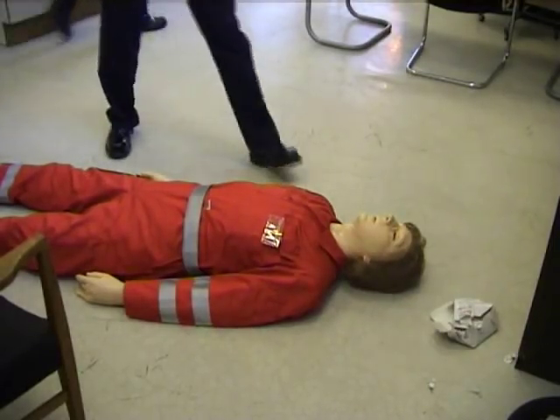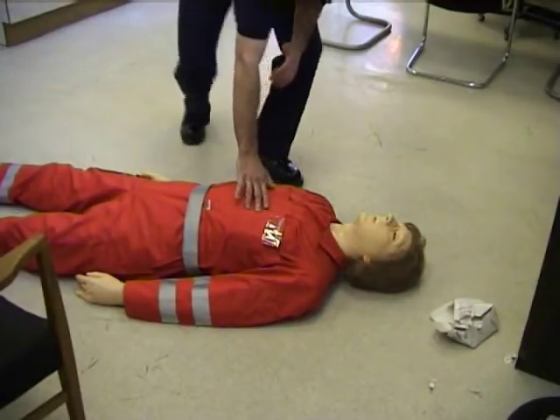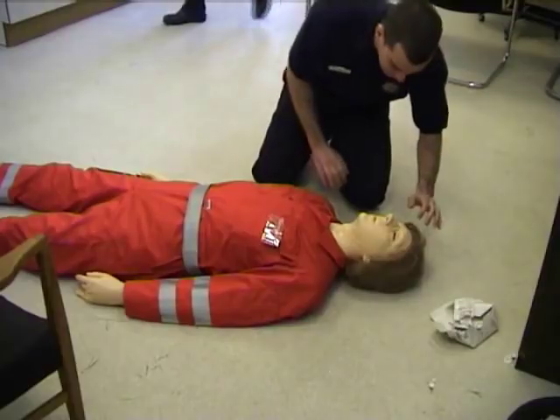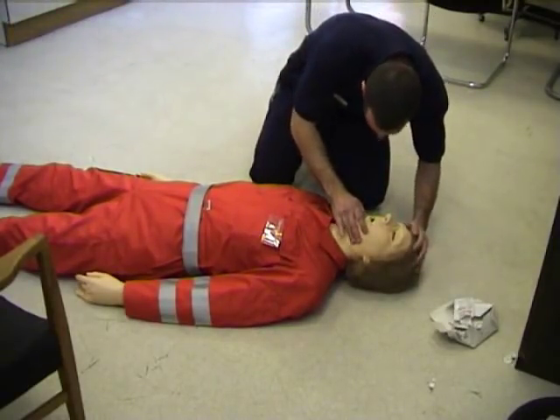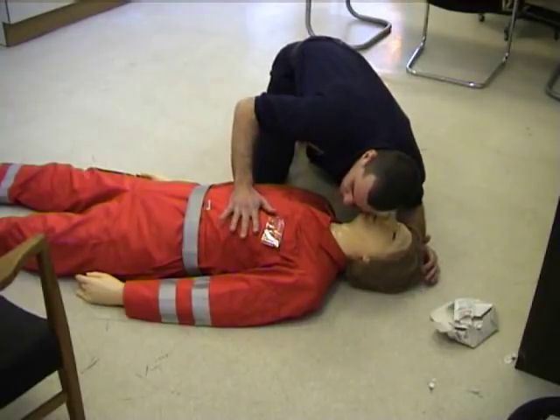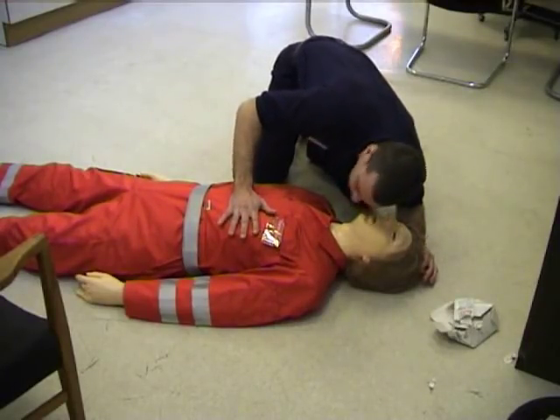Hello, can you hear me? Hello, hello. ABC — I'm checking the ABC. Airways clear. Checking for any sign of breathing. No sign of breathing.